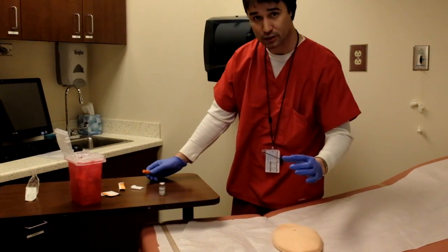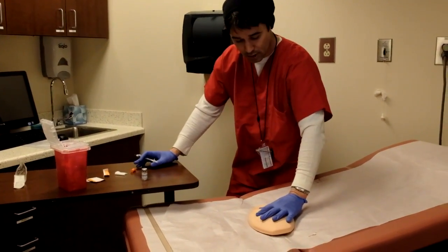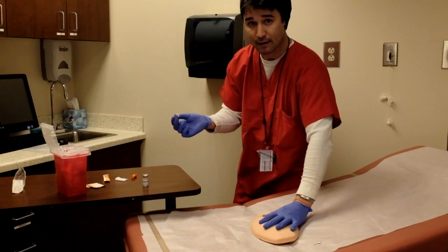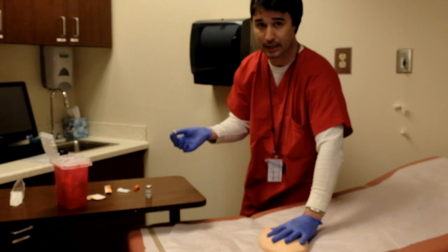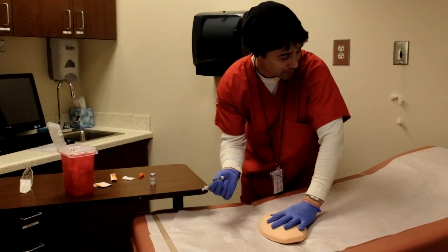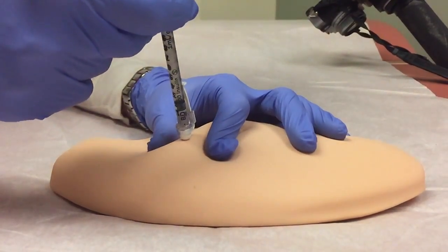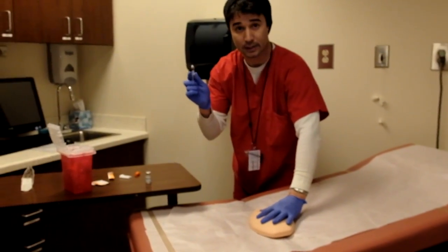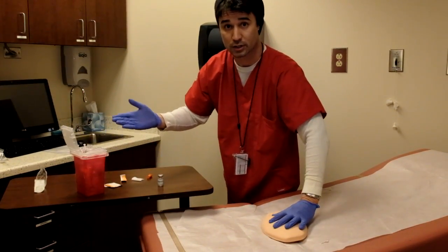We're going to grab about a one inch fold of the skin. Now we'll hold the syringe like a dart, and we'll go in at either a 45 or a 90 degree angle. If you have a larger patient with a larger fold of skin, you probably want to go in at a 90 degree angle; otherwise, around one inch, we're going to go in at 45. Ask the patient to breathe out — breathe out — and put it in. We'll go ahead and slowly push the medication in. Once we've done that, pull out, flip the syringe, and engage the safety. Dispose of the syringe in the sharps container.